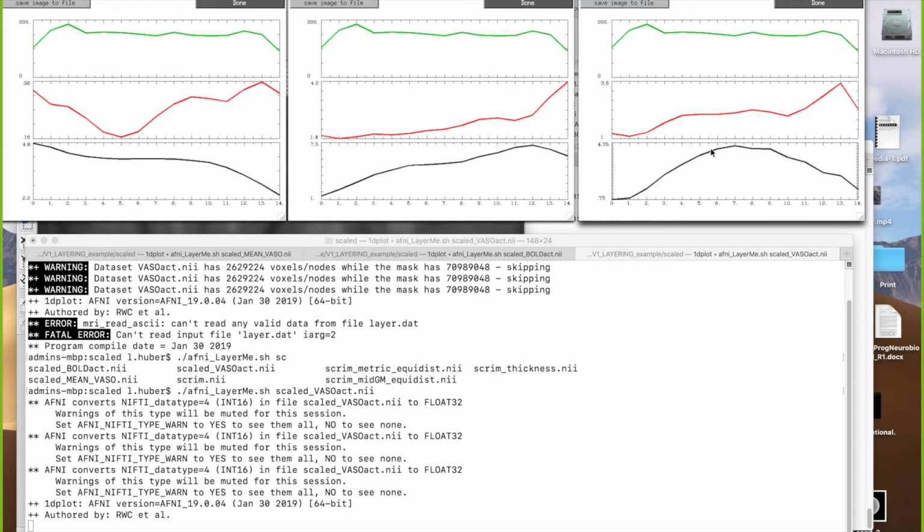All right, so this is basically how I do the layers. I upsample it quite a bit and then extract the layers not to have these biases. How is the time? I talked about 45 minutes, so maybe I make a short break and ask for questions, and then talk about the different algorithms of layering for maybe 5 minutes.